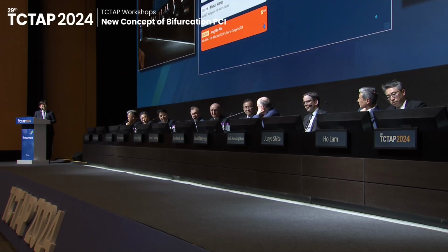Gerald. Yeah, it's very impressive, the deduction of the values, but it's a Korean population. So the transfer to other populations, other sizes of people, is difficult, I think. That's why I would like to have a relation between the size that you achieve and the residual plaque load that could be something transferable to other populations. Did you do any calculations about the residual plaque load in these different regions?